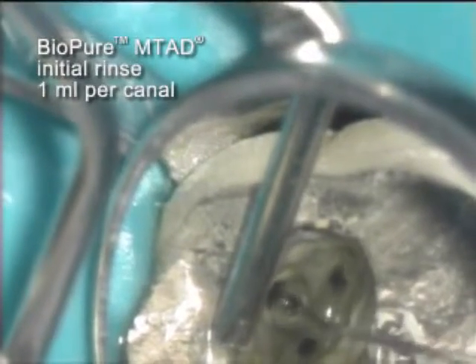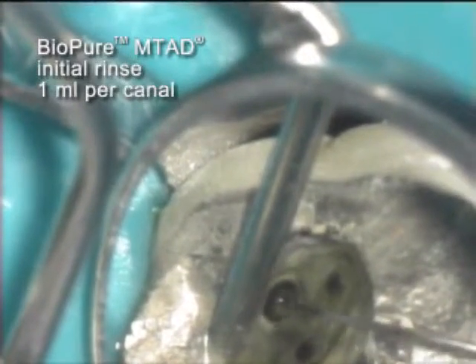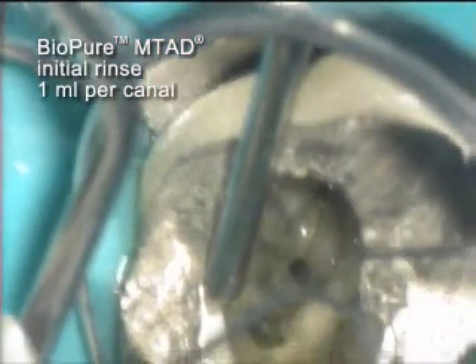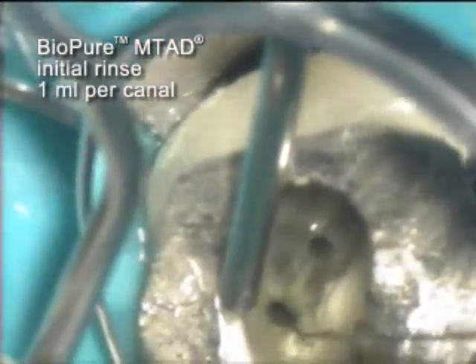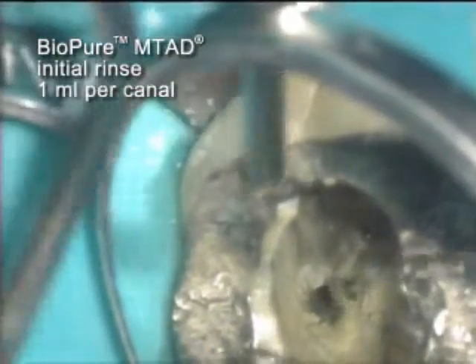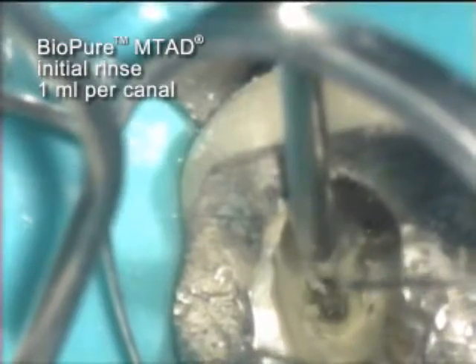Each canal receives one milliliter of BioPure MTAD, delivered as close to the apex of each canal as the 30-gauge side-vented needle will allow. During the initial application of the BioPure MTAD, the palatal canal presents an obvious reaction.